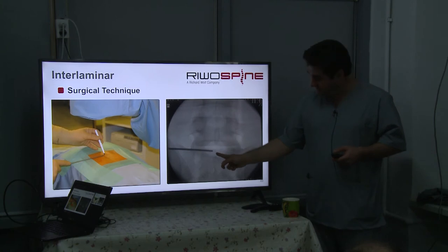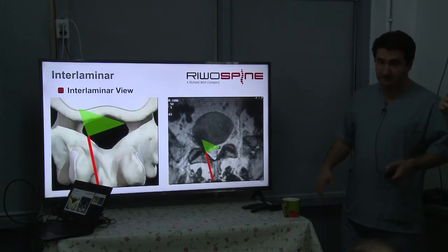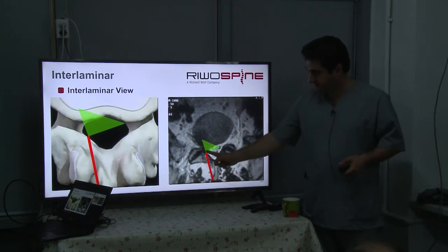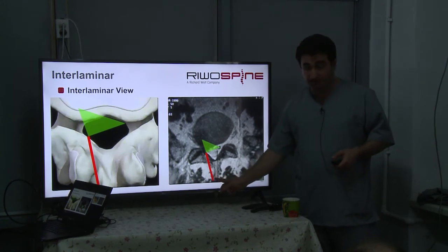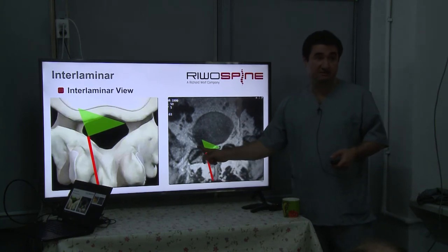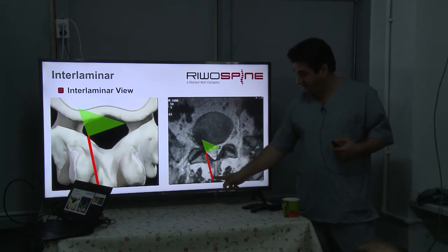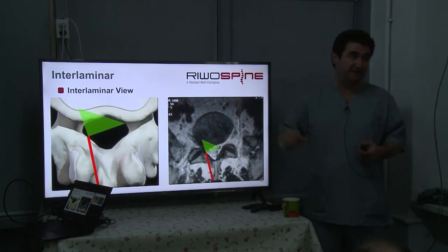ligament here. Just lateral to the midline. It's very important to come from medial to lateral, because there's a facet joint here. If you mark the lateral point, then you will have a problem with the facet. Not to have a problem with the facet, we mark from medial to lateral, and you can easily reach the ventral epidural space here.